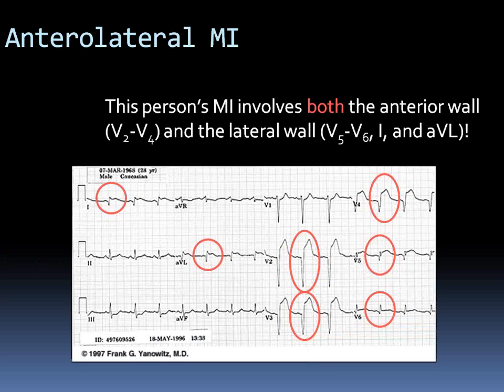Now, so far we have gone over myocardial infarctions, we have gone over heart blocks, we have gone over VTs, we have gone over AFibs and SVTs. What are you guys not comfortable with? I really want to know if there's a portion of today's lecture that you guys want me to repeat or go over more in detail.